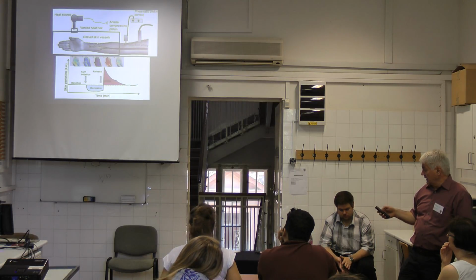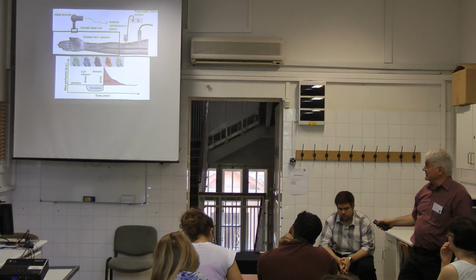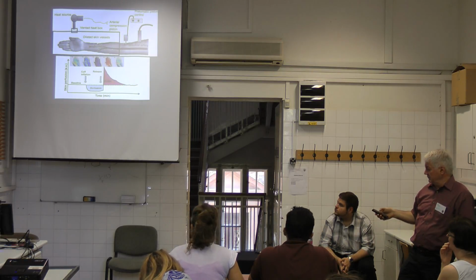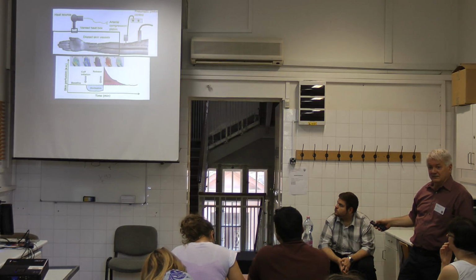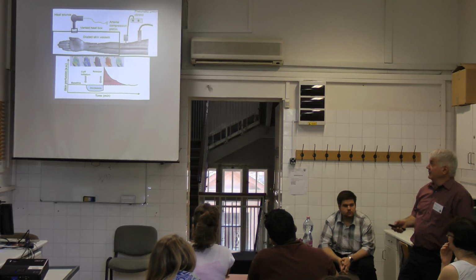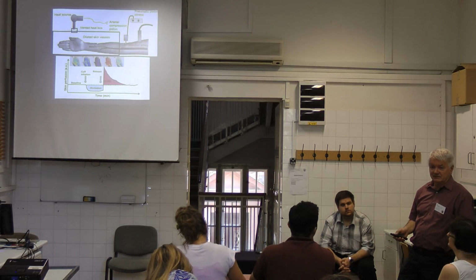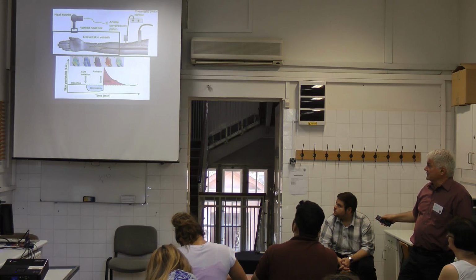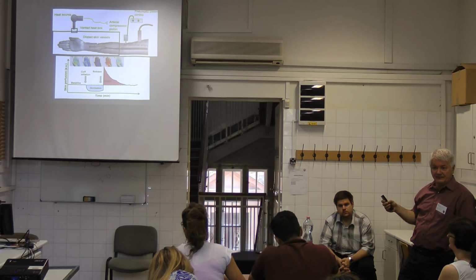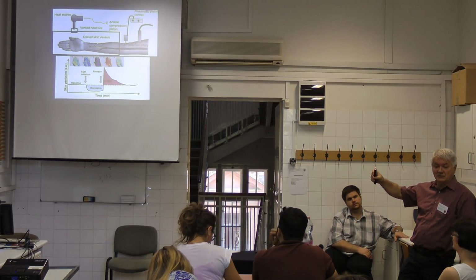And what is it indicative of, or what could be the indication? For example, how big is the compensation peak? How big is the area under this curve? Because normally, we lost something during this time, which can be repaid, overpaid, or not repaid. If we look at the microcirculation of, for example, severe diabetic patients, there is almost no post-occlusive reactive hyperemia. So using laser Doppler perfusion imaging was very important to figure out the microvascular changes in diabetic patients or kidney failure patients.